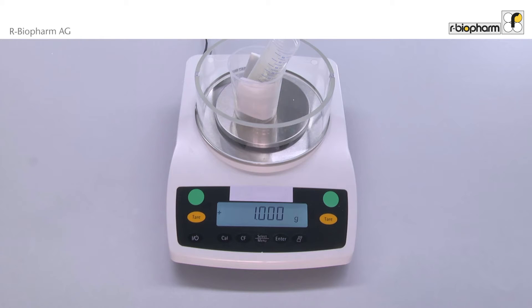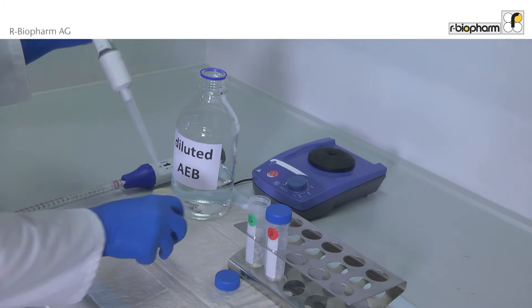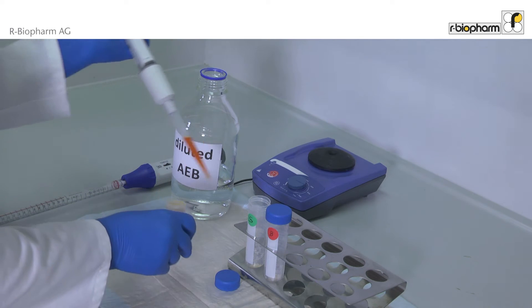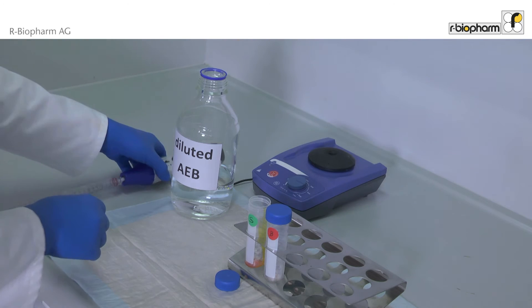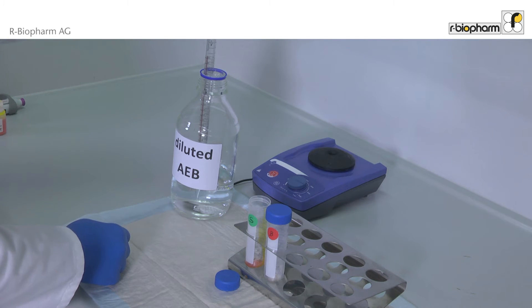Then weigh in exactly one gram of homogenized sample. Work under a chemical hood for the next steps. To one gram of sample, add 2.5 milliliters of Extractor 3 and 17.5 milliliters of diluted allergen extraction buffer heated to 60 degrees centigrade.